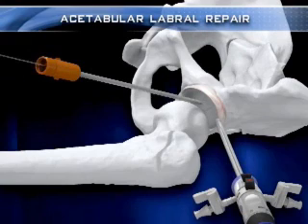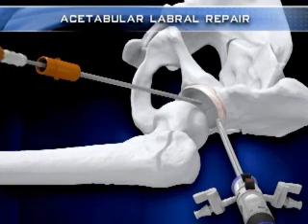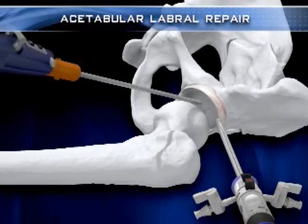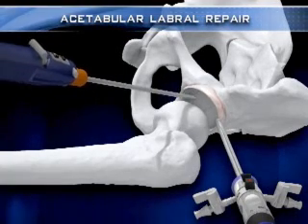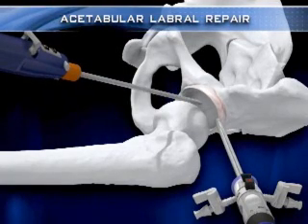The shaver's outer sheath can be easily introduced into the joint over the guide wire by separating it from the inner sheath. Once in the joint and reassembled with its inner sheath and shaver handle, it is used to create a large capsulotomy, making room for instruments to move freely around the hip joint.